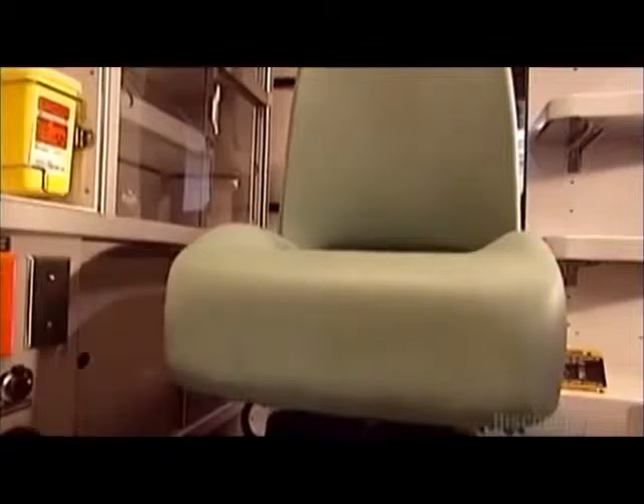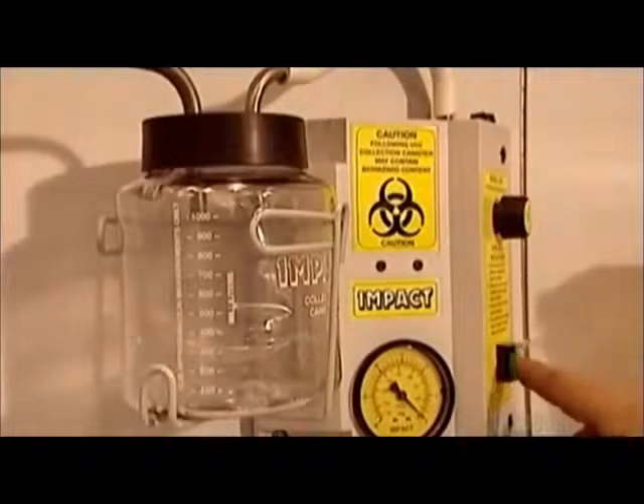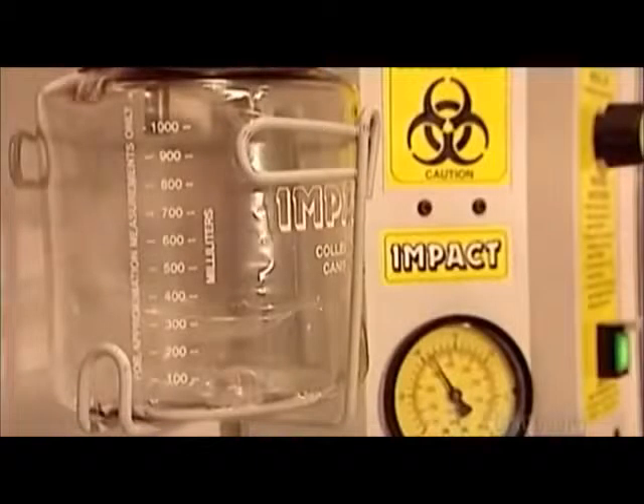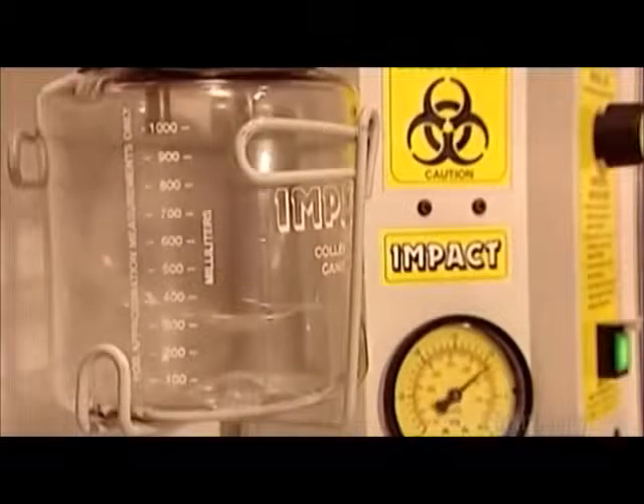The medical area has a swivel chair positioned where the patient's head will be. Within reach of the chair is the suction machine. The factory thoroughly tests it, along with all other medical equipment.